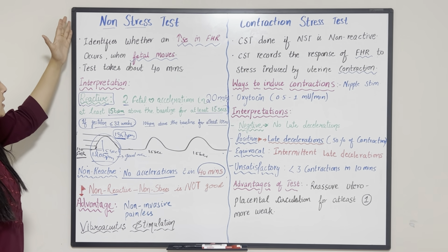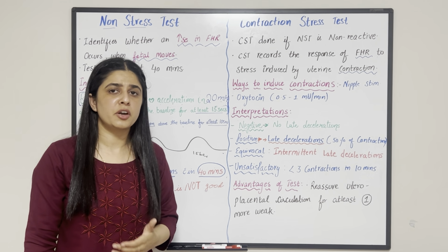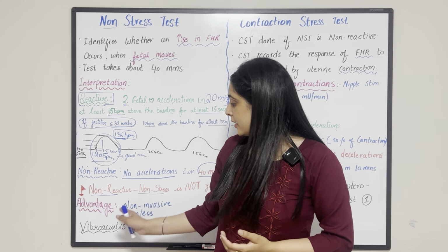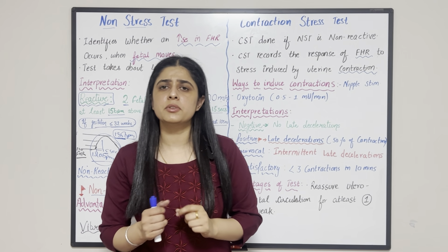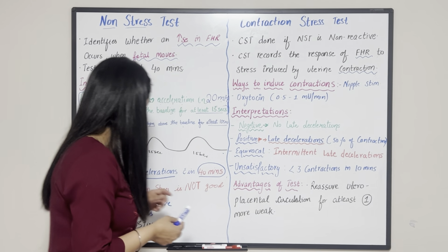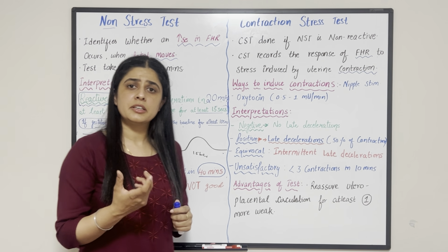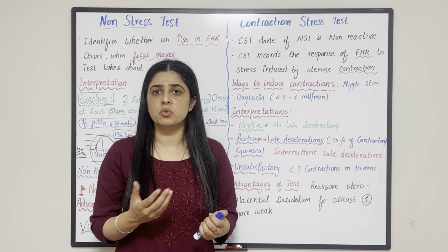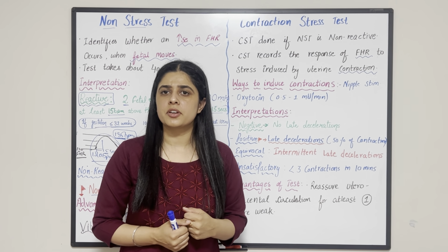So what are the basic advantages of the non-stress test? This is non-invasive. We are not imposing any stress on the mother or the fetus, and it is painless. But the disadvantage is that sometimes we get false positive results, meaning false non-reactive results. Sometimes the fetus is in deep sleep and doesn't move. Whenever your fetus is in deep sleep and doesn't move, then the fetal heart rate doesn't increase.